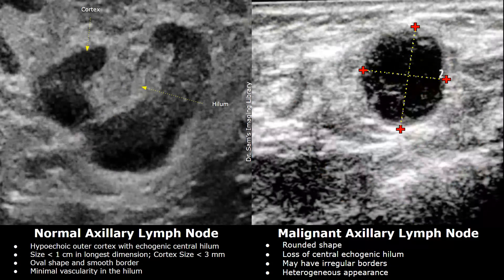A malignant axillary lymph node is associated with cancer. It will have a rounded shape — it loses its usual oval shape and appears more rounded. Another main feature is the loss of the central echogenic hilum; we do not see the central bright fatty hilum in a malignant lymph node. Overall it will have a heterogeneous appearance with mixed echoes.